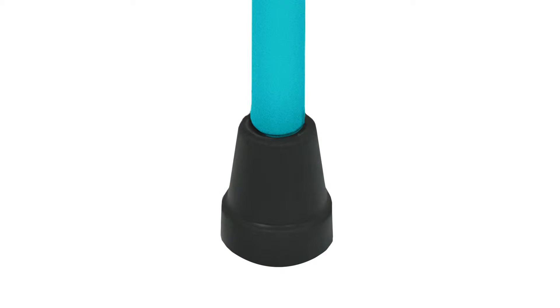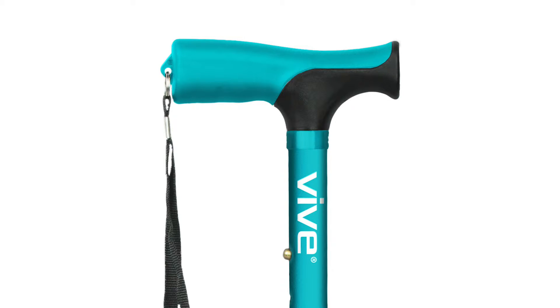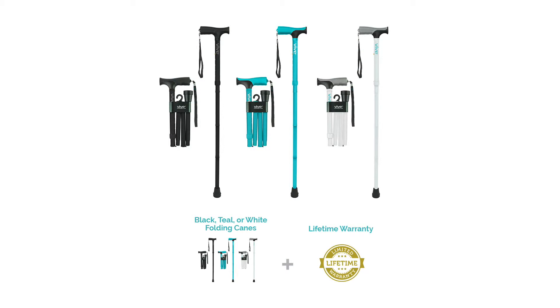It comes with an anti-slip rubber foot to prevent falls and keep you safe. The ergonomic grip handle is designed to contour to your hand for added comfort and is protected by a lifetime warranty.